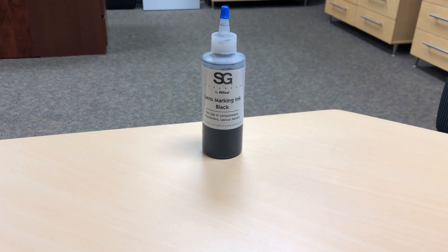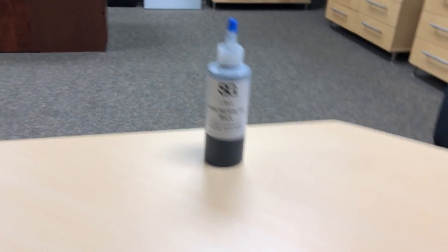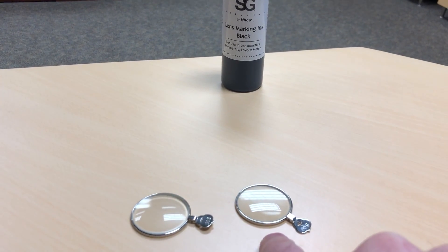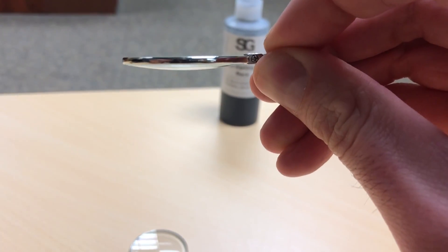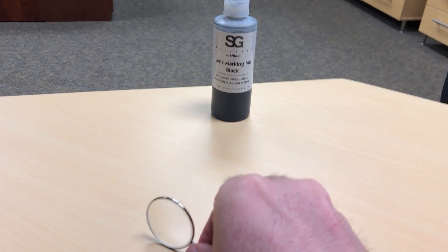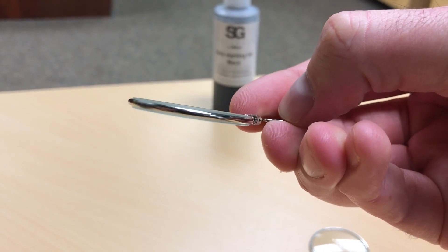These are lenses when they're cut down to a smaller size. It's a minus six and a plus six. You can kind of see how the plus six has a convex shape, and the minus six is a little concave.